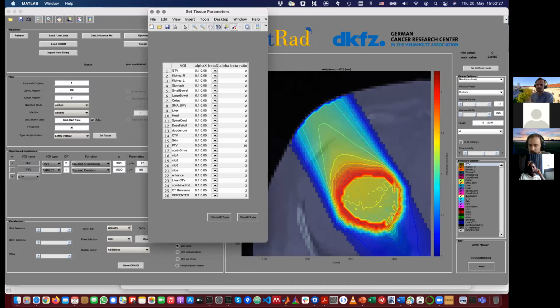It's really about you seeing and feeling, if possible, how it works to work with these quantities and these differences and these features and issues that you have to deal with when you plan with ions and protons. It's not about you recreating everything that we do and having the exact same results. It's more about getting the feel for it.